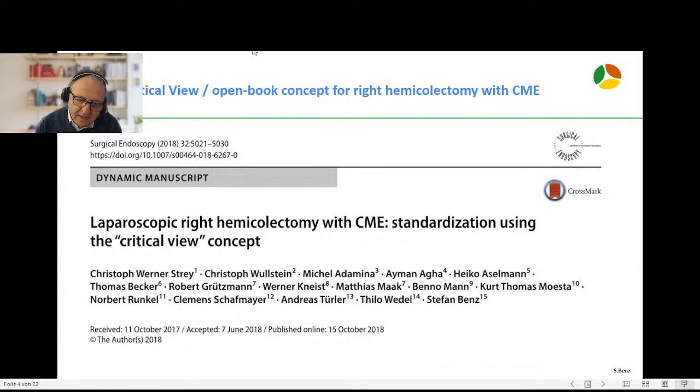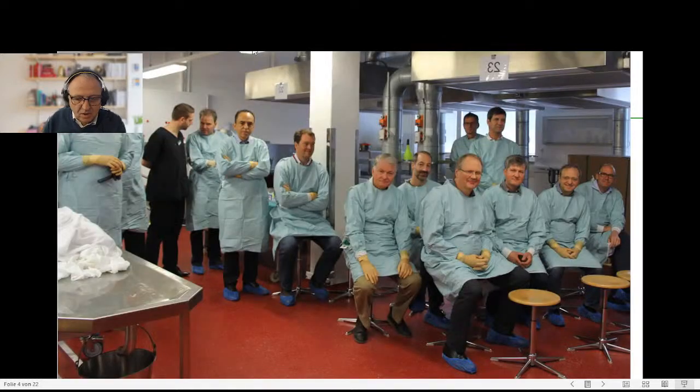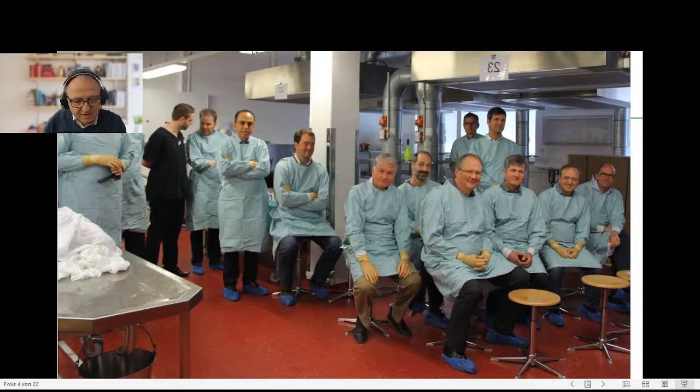We developed the concept consisting of two important aspects: the critical view concept, which makes a step-by-step approach in which each step is concluded by a critical view of safety, just like it's known from laparoscopic cholecystectomy. And the other thing is that these critical views are based on the open book model.